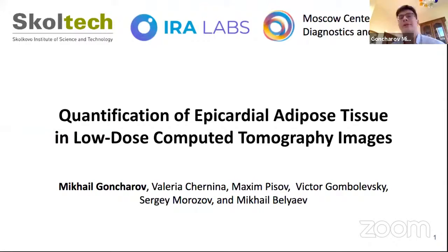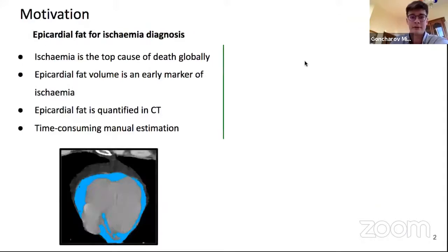I'm just a Russian deep learning developer, and I'm very glad to present here our work, which is quantification of epicardial adipose tissue in low dose images. You can see epicardial adipose tissue in this picture. I will shortly call it epicardial fat.